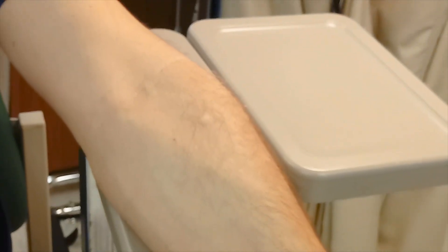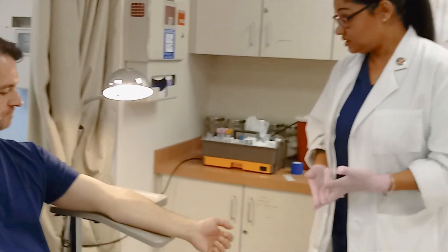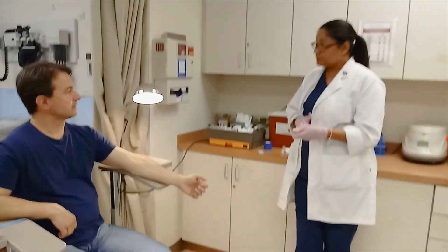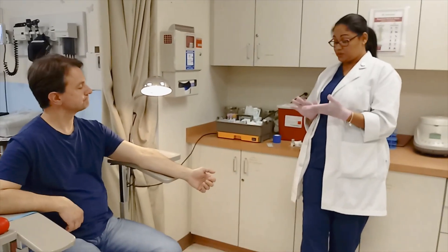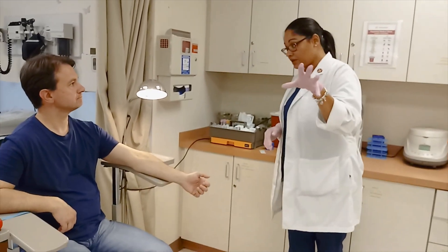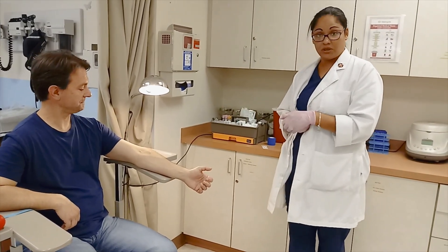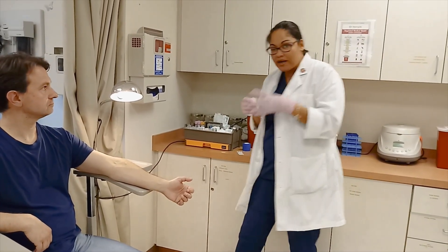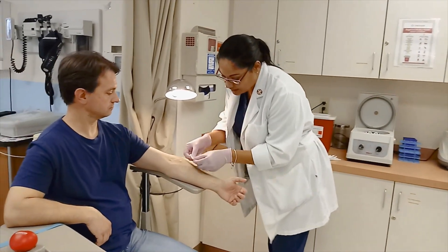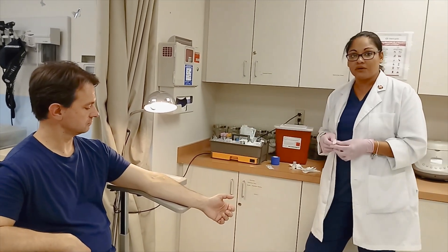Instructions to the patient: please do not wash it, do not rub it, do not scratch it. I need you to come back in 48 to 72 hours. Today is Tuesday, so come back on Thursday around this same time and we'll have it looked at. The most you might do if a little bit of liquid comes out is just dab around it, but otherwise leave it alone.